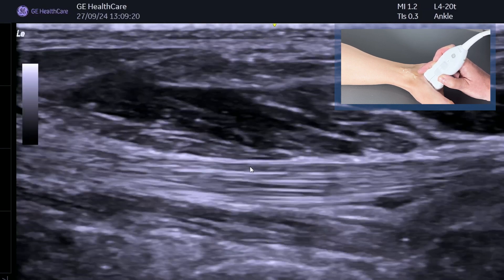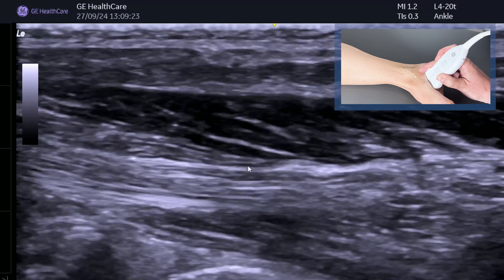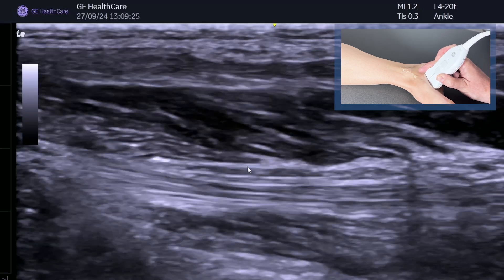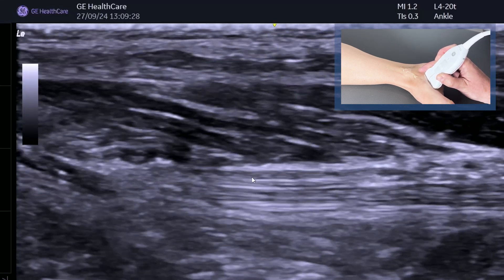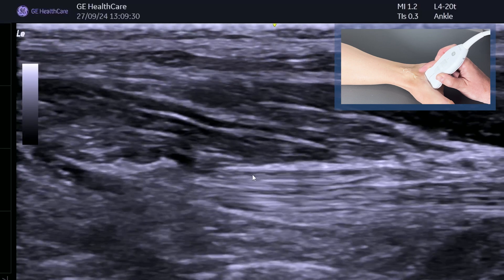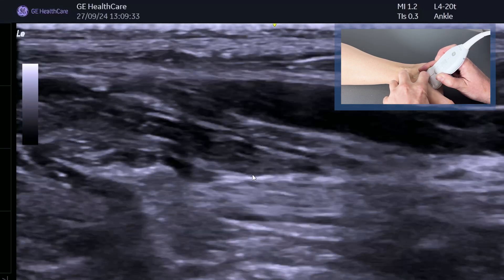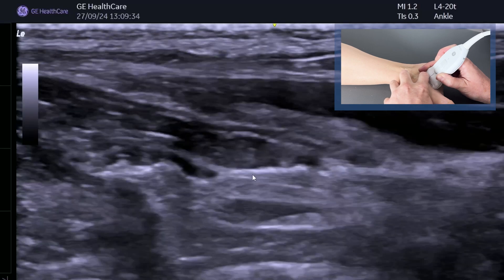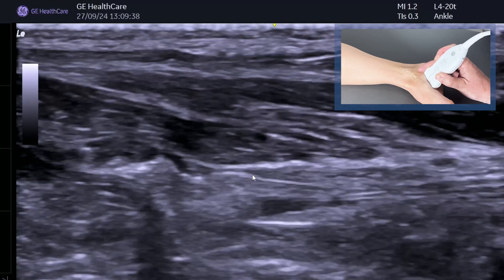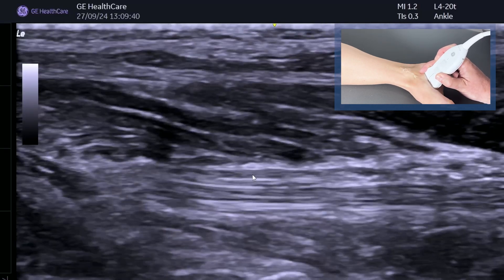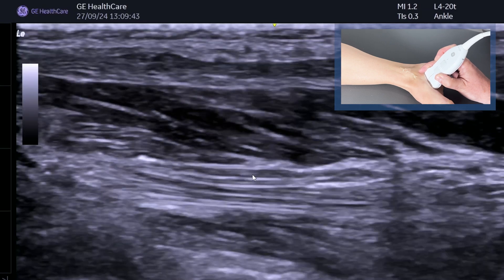We can get it in oblique, which we've got here. If I then just move the FHL, you can see a bit of the FDL on top — and that's where you're going to look for that pain. You can also just palpate it with your finger to see if that indicates where the pain is coming from. But often you might need to do a local anesthetic injection just to identify that that's where it's coming from.